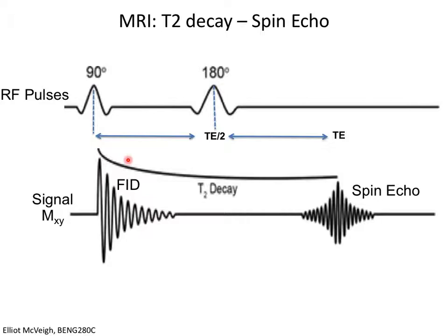Sometimes when you're imaging a patient and you really want to focus on their heart, you will shift them slightly in the bore of the magnet such that their heart is centered up in the middle, or the sweet spot, of the imaging system.